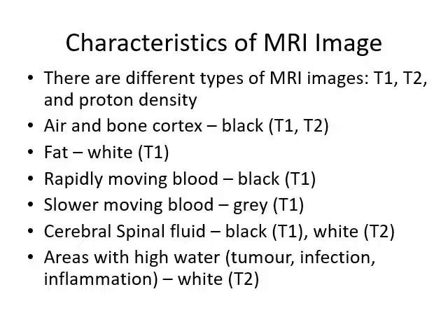If you remember back when we were talking about the bone, the outside layer of the bone has very little water. It's very hard. It doesn't have very much water in it. Remember, with the MRI, what we're doing is spinning around those hydrogen atoms that are in the water molecules. So if we have less water in there, we're going to end up having not as much energy that's released, so it's going to come up as being black. The bone sometimes can be whitish or grayish or very dark gray, but that surrounding usually turns up as being black.